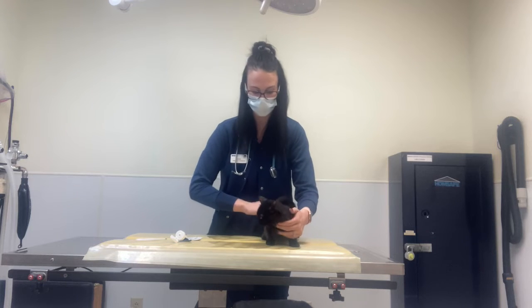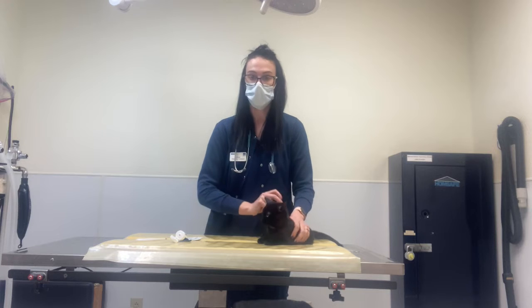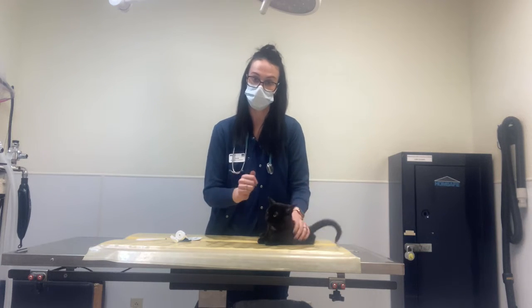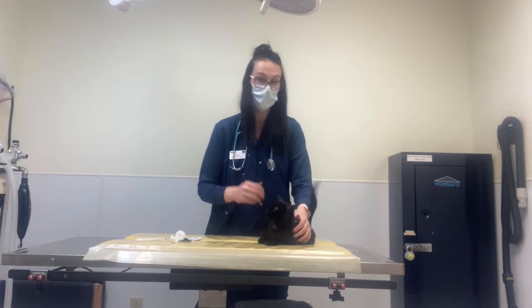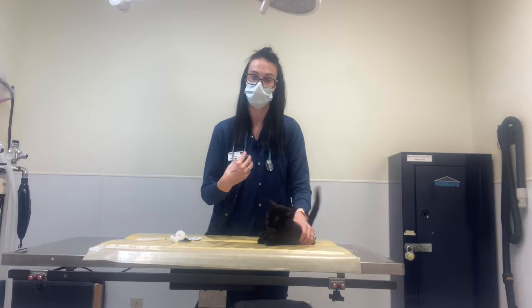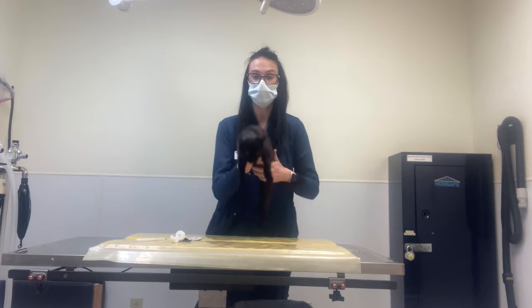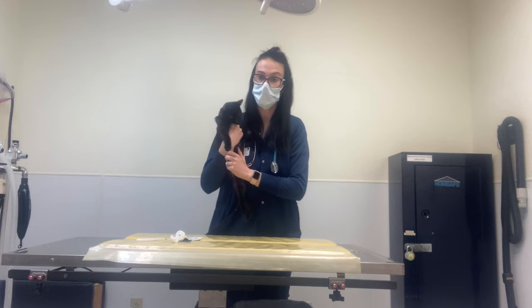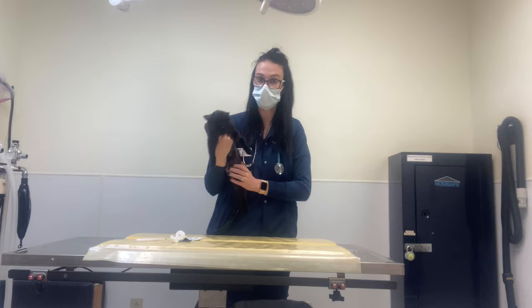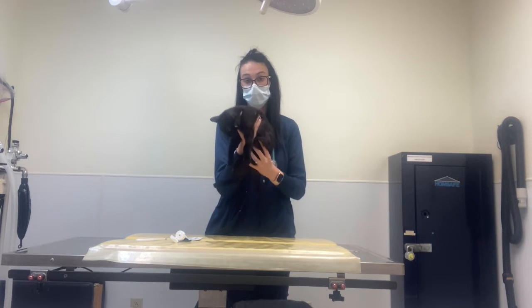I don't blame her. But if she were to come up with a fever, the doctor would need to know right away, and we would possibly postpone surgery if she had a fever, if her heart sounded odd, or if her lungs sounded weird. So that is how you TPR, listen to heart and lungs, and assign an ASA score for a kitty cat. Like I said, she has no underlying conditions. She's a pretty healthy girl, so her ASA score would be 1.